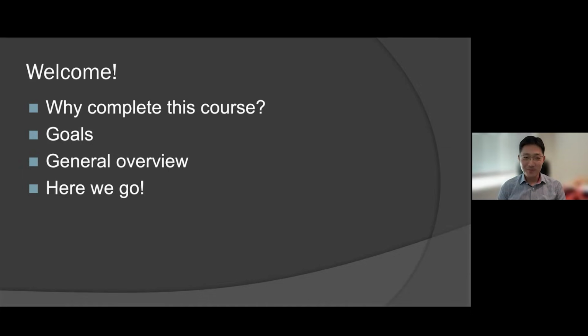The overall goal of this course, I say goals, but really it's one goal, is to get better at ILD assessment on HRCT. It can be challenging. When I talk to my friends in general practice, they say it's common enough where it's irksome, but it's not common enough where you get good at it.